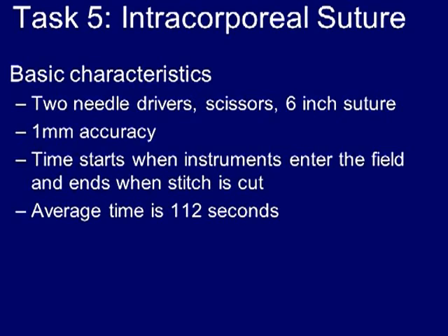For this task, you again have two needle drivers, one pair of scissors, and one suture cut to six inches in length.